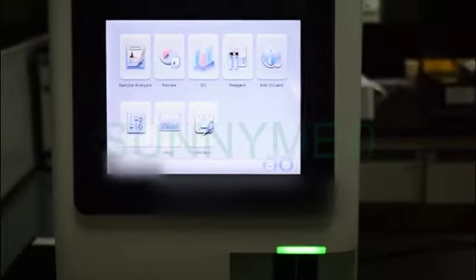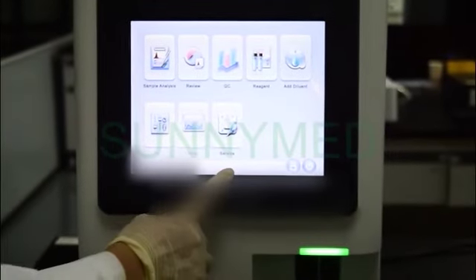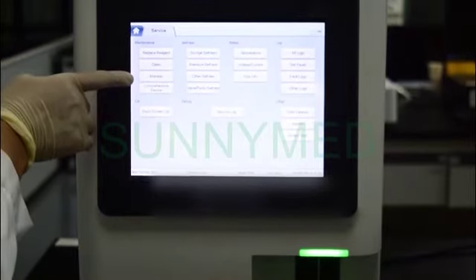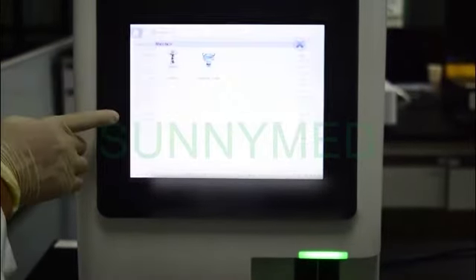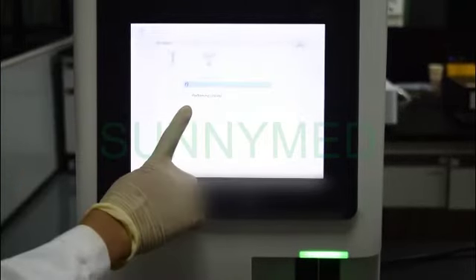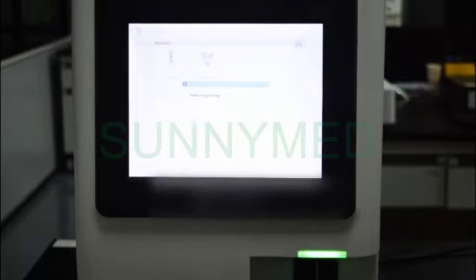Step 2: Unclog. If clogging is found, or it is suspected that the counting results are not accurate due to aperture clogging, you can perform the unclog operation by clicking the service icon in the main menu. Then click Maintain. After that, click the icon of Unclog to proceed.